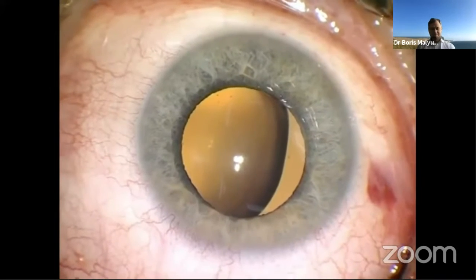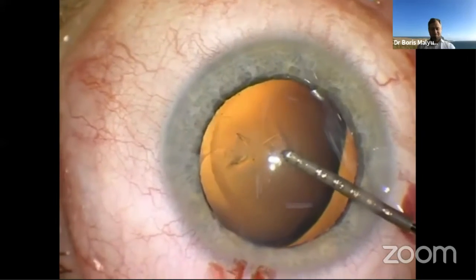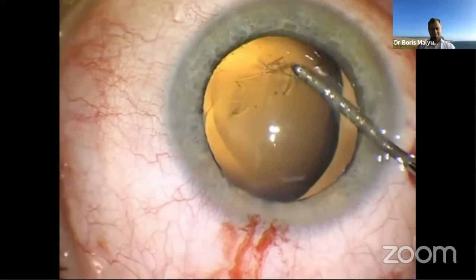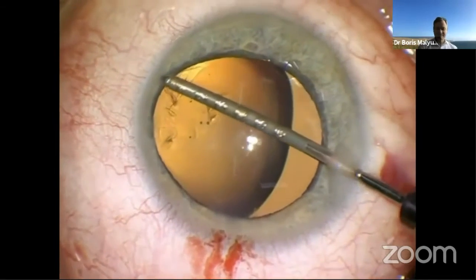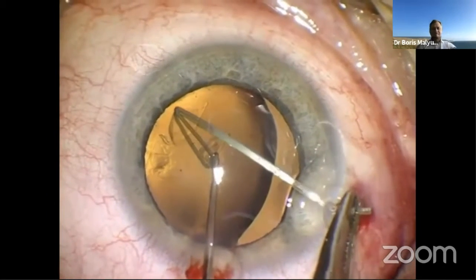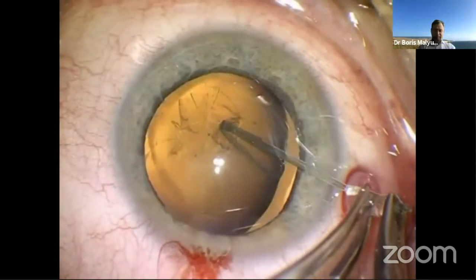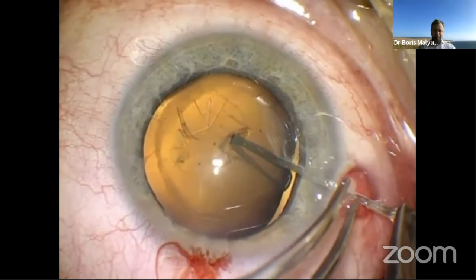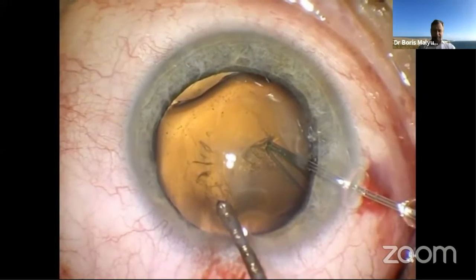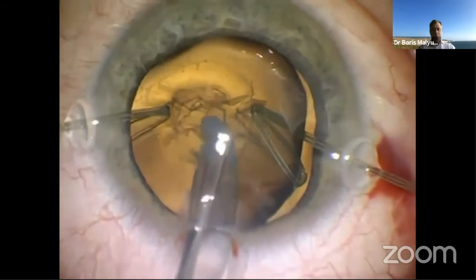Here is the clinical case of a patient having Marfan syndrome. As shown here, capsulotomy is initiated with microforceps. Following that, the capsular bag was stabilized with special capsular hooks introduced through the opening in the anterior capsule, as shown here. This is a very useful device because the tip of the capsular hook rests at the equator of the capsular bag and does not cause a lot of stress on the edge of the anterior capsulorhexis. This is followed by aspiration of the relatively soft cortical material.